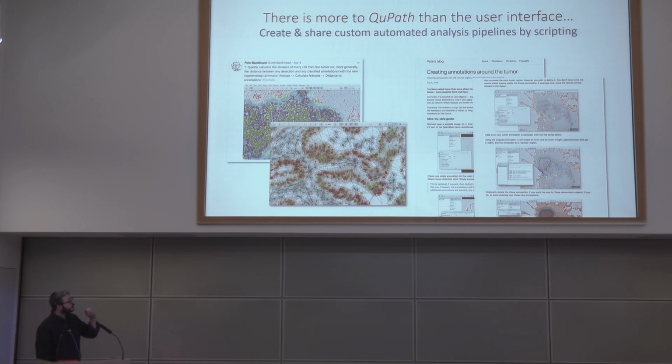So what I didn't really speak very much about is interrogating the data, but already within QuPath there are some tools that allow you to calculate a triangulation, so you can begin to look at cell neighbors. There aren't really user-friendly tools to query this at the moment. That's another thing that I think needs to be worked on. But I'm interested in how do you query this data? How do you establish distances from whatever you might want in the most generic way?